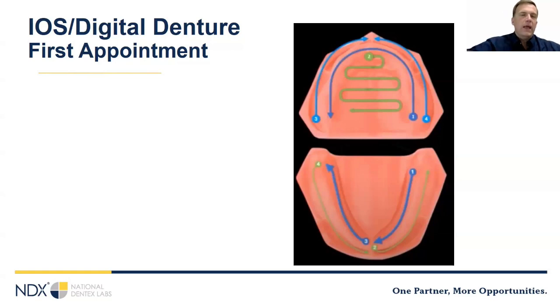The first data set, we add more data to get the buccal and lingual walls, etc. Italian prosthodontist Dr. LaRusso, shown above, has done a study and found that this is the most predictable way to scan for dentures. And again, as a good question before, you want to make sure you find a way to indicate on the scan where that vibrating line is, so your lab can extend the border correctly.